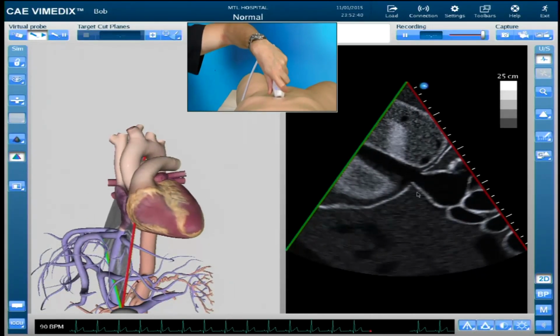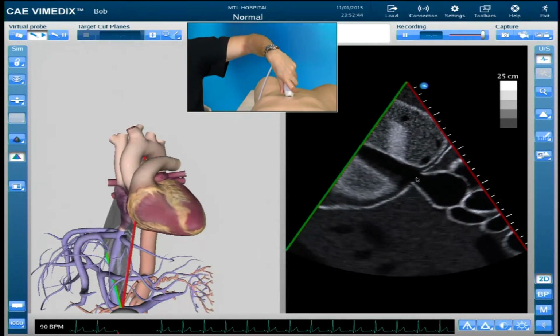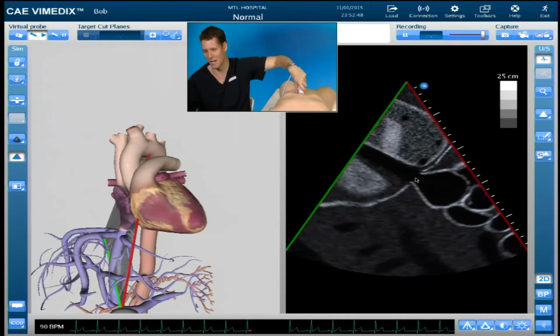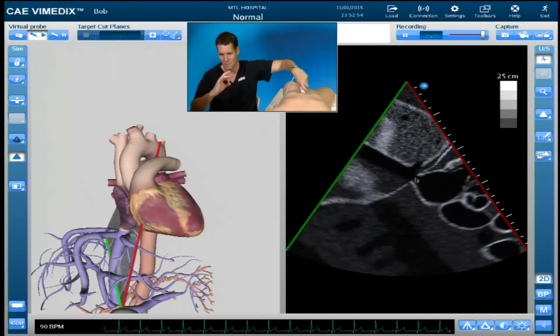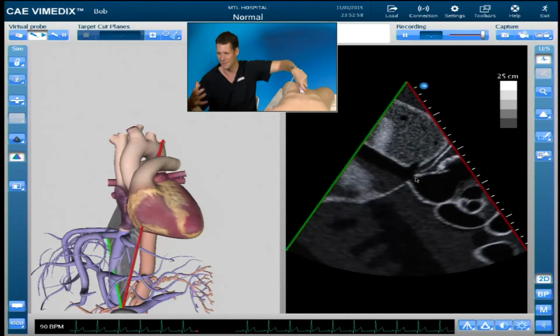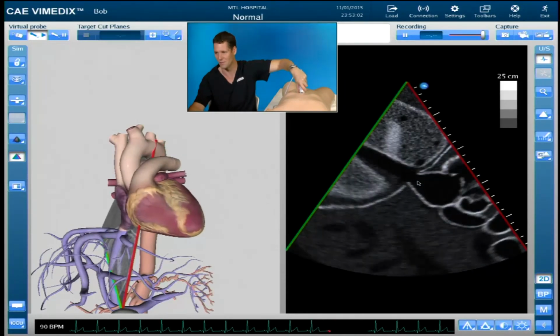I kind of describe this movement as a bit like if you're putting in a central line into the IJ, that if you want to move it from being a perpendicular view where you're looking at a circle to looking at it in a longitudinal format, again, you bring that IJ into the middle of your screen and then you rotate it around very closely, watching it as you do. And this is a similar kind of format where you've got that IVC-RA junction.